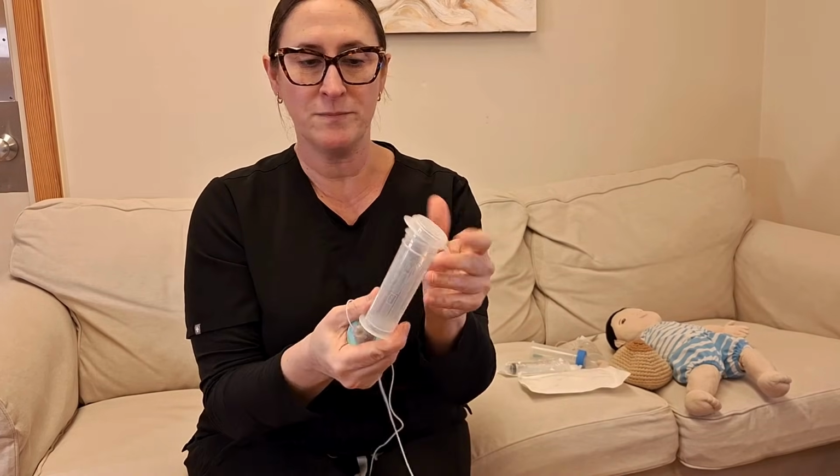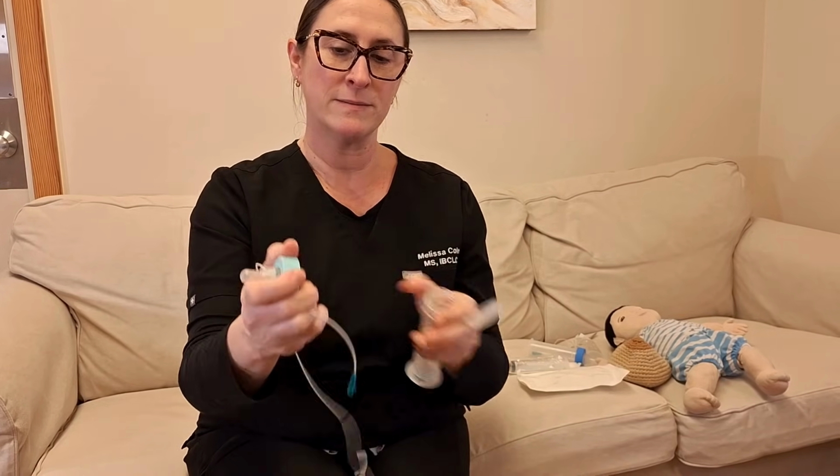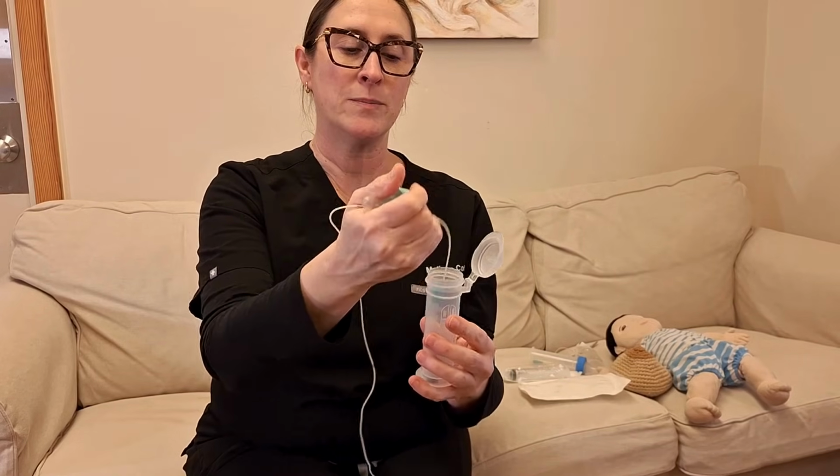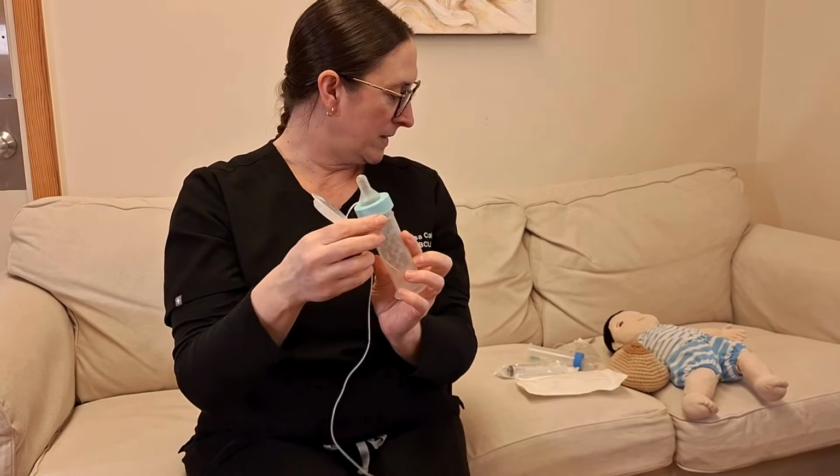Can take our receptacle of choice, bottle base, and this will be filled with whatever extra supplement your baby needs. So this works with anything, whether it's human milk or formula, the concept is the same. Right, so now we've filled it with whatever your baby is drinking, and we put the cap on.